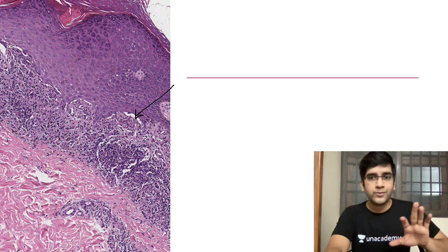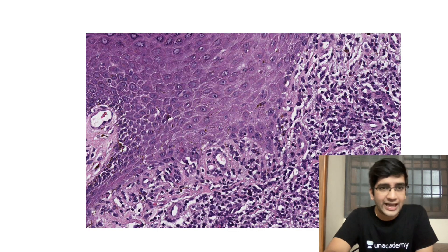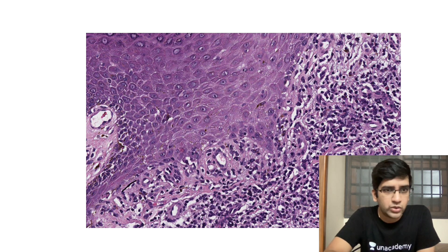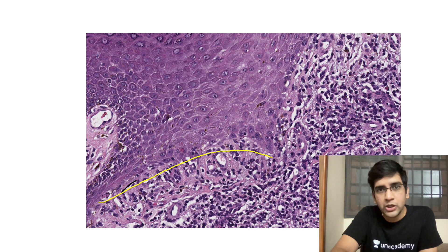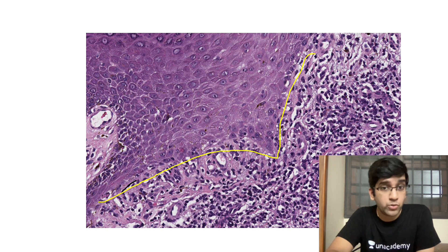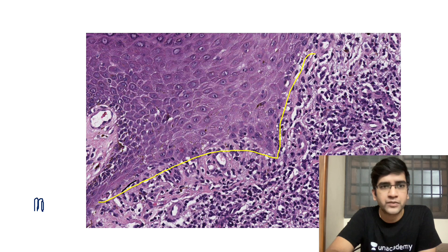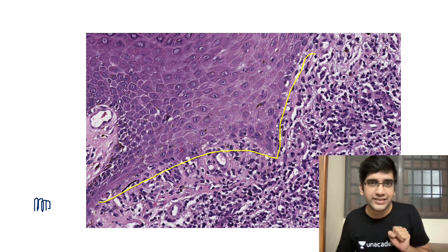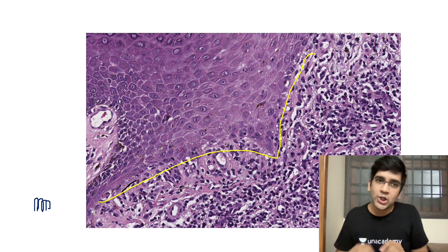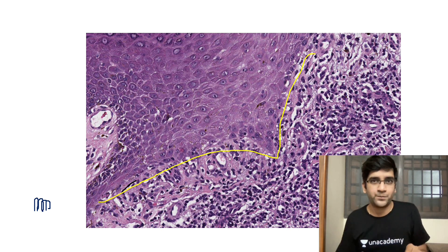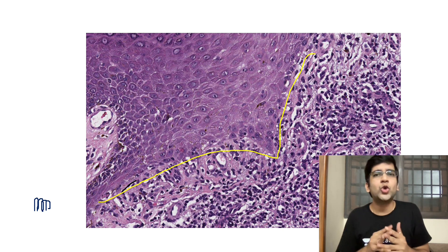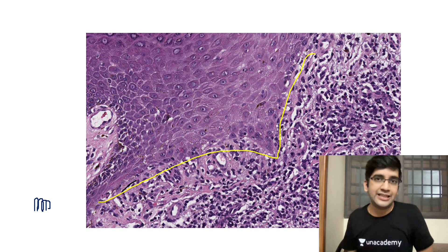Next image — going to a higher power. This is my basal layer, marked in yellow. This is my basal layer of epidermis; the below is dermis. Normally the basal layer is read as a row of tombstones — vertical and parallel. But when you look at this image, it's neither vertical nor parallel to each other; it has become flat. That's a very characteristic finding seen in this disease. We call this squamatization of basal epithelial cells.